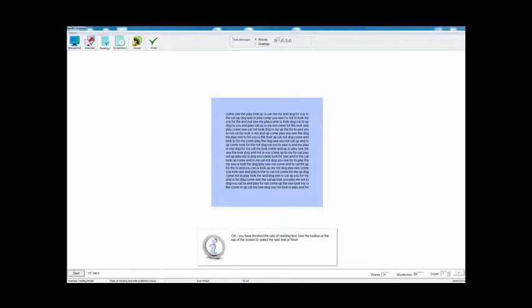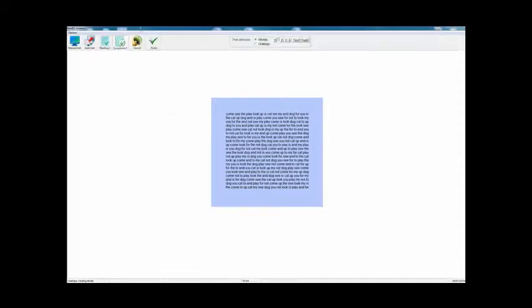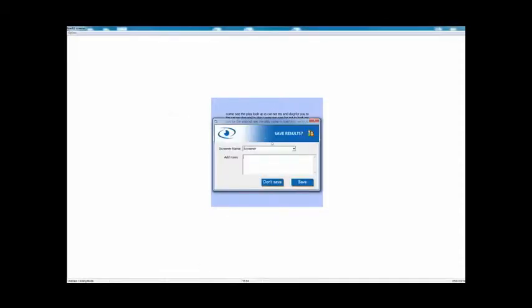It doesn't necessarily mean that they can read any faster or that it's reduced their symptoms, so we then repeat the rate of reading test. Again, start the clock and the patient reads. Hopefully now with their preferred color in the background, they'll read faster, more fluently and make fewer errors. You'd normally record for a minute, but I'm stopping the clock now. That's 86 words per minute. As a final stage, you check their symptoms again, this time with the blue background. If the color has helped, the symptoms will be reduced. Then once again, click on finish, enter any comments, and save the result.